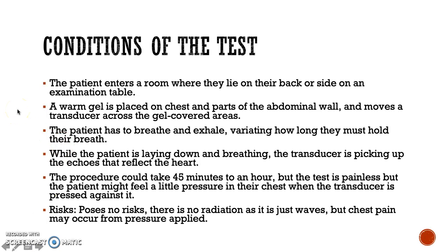So, conditions of the test. A patient enters a room, they lie on their back and side on an examination table, and a doctor or a technician will come up and place a warm gel on the chest or parts of the abdominal wall and move the transducer across the gel-covered areas. The patient has to breathe and exhale, varying how long they must hold their breath. While the patient is lying down and breathing, the transducer is picking up the echoes that reflect off the heart. So this is what I was talking about with the waves coming back into the transducer, and the device basically creates an image from those waves.